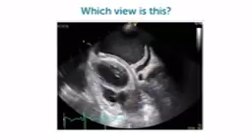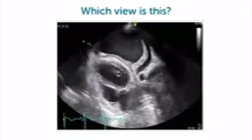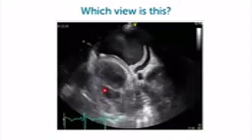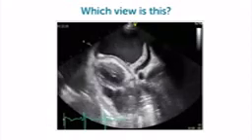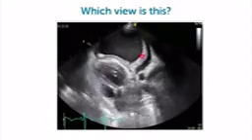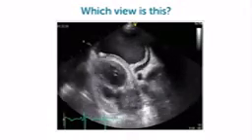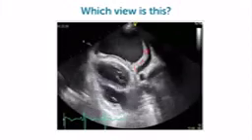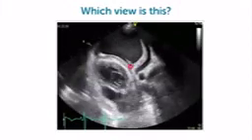My question to you, from where was this image obtained? It's not a subcostal view because we have the left ventricle here in front and the right ventricle here in the back. This obviously was imaged from the back. Because the patient has a pleural effusion, we're even able to see the heart. The free fluid, the atelectatic lung, which is collapsed due to the fluid. This is the pericardium, and this is the left ventricle. So you can see we can be very creative if we have a pleural effusion. And sometimes this is quite helpful in patients who are not easy to image from any other position.